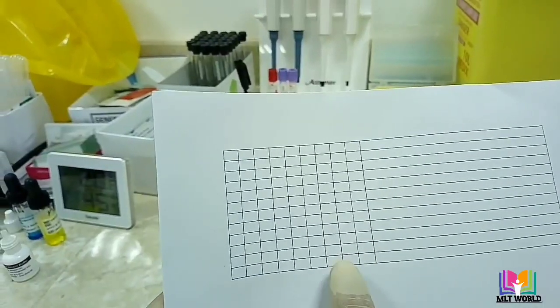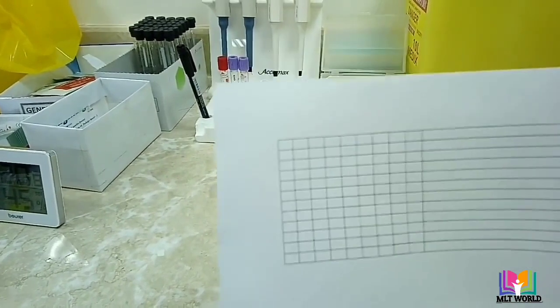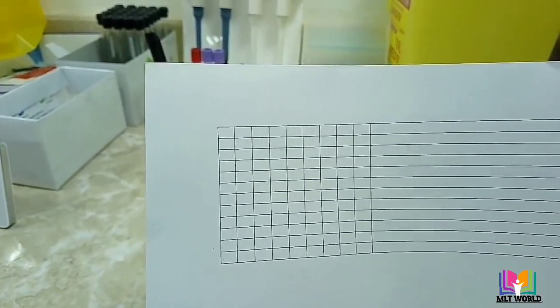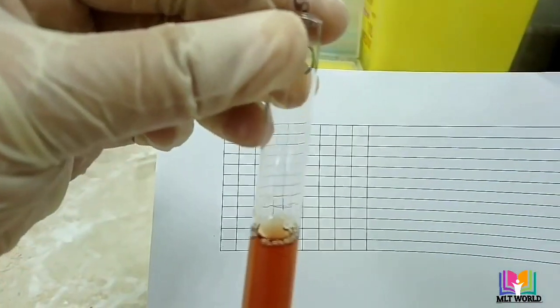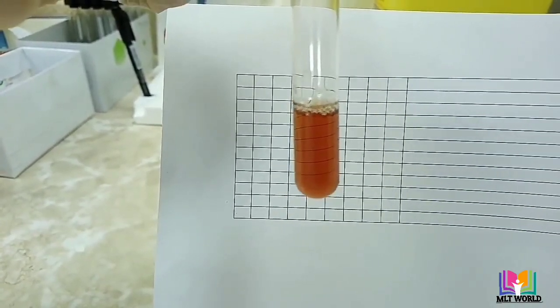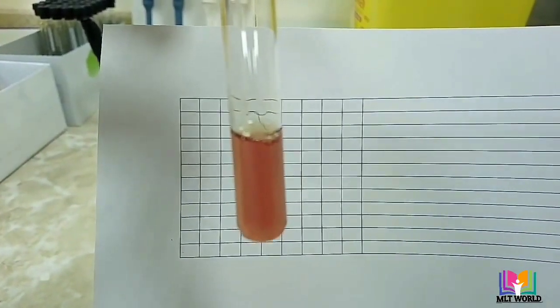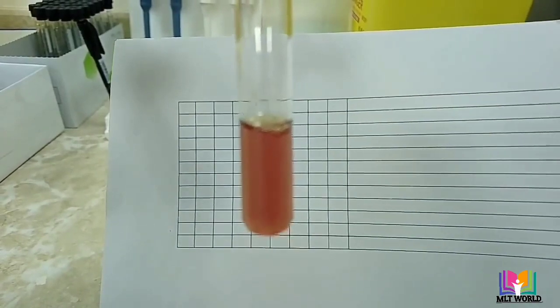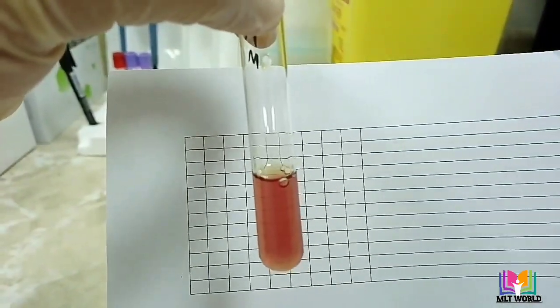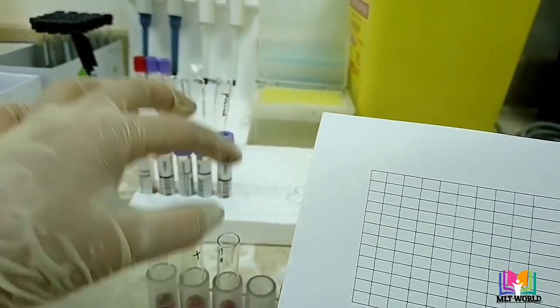For result reading, place the tubes in front of a paper with printed or drawn lines. For the negative control, you can clearly see the lines behind the sample — this means the result is negative. For the positive control, you will see turbidity, and because of that turbidity you cannot see the background lines — this means the result is positive. For the patient sample, if lines are visible, the result is negative.